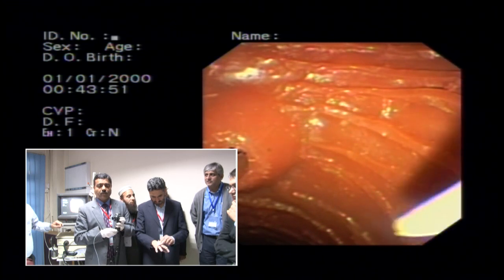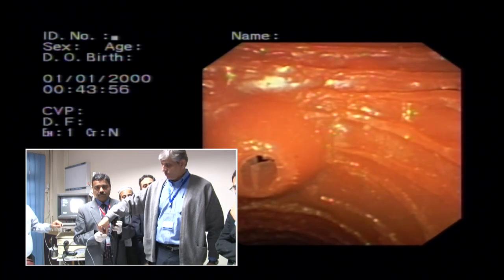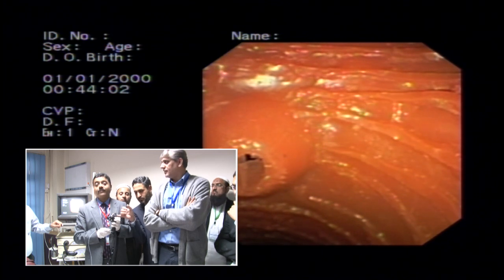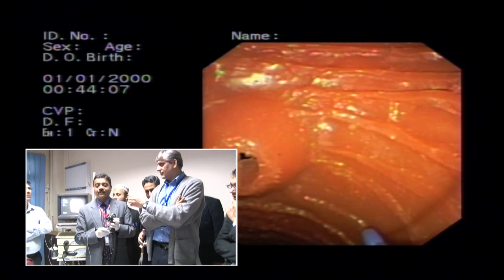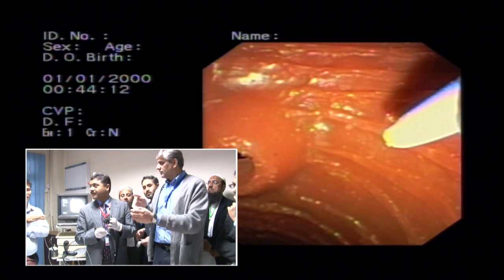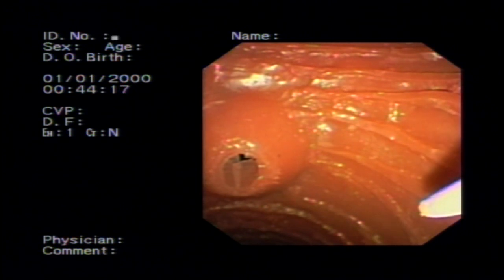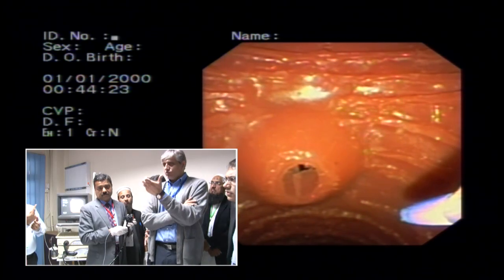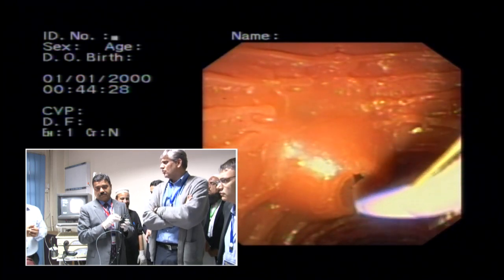You are, sorry, that is standard. Because if you don't, just leave it, push back. Don't use the elevator, just push the cannula down. Keep pushing. What's happening? So elevator, I'm sorry, we are assuming that you would understand that without elevator you can't put the cannula. No, that's obvious. But when we are going inside and when you were going in order to make the position right, I mean in that case, elevator helps. You can use the elevator also to push the thing in. Okay, but most of the time you really don't need to.